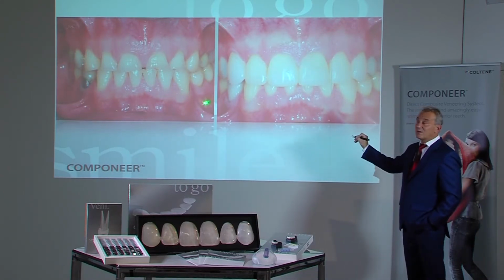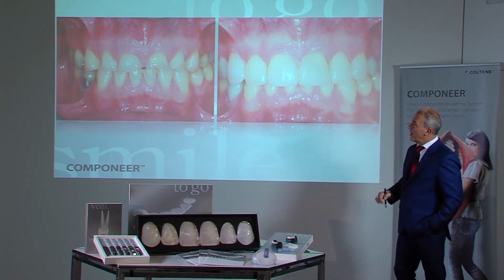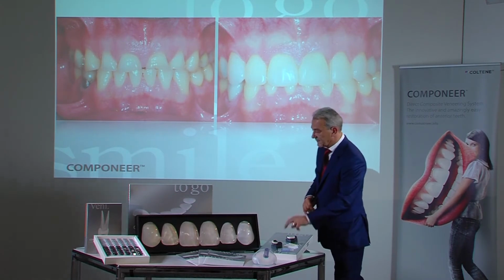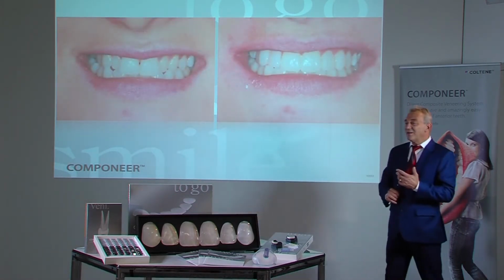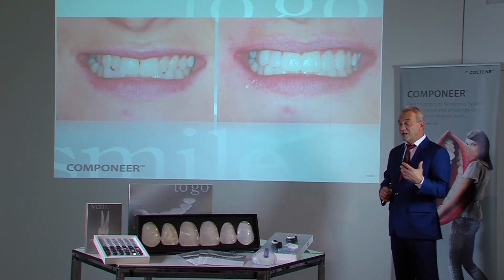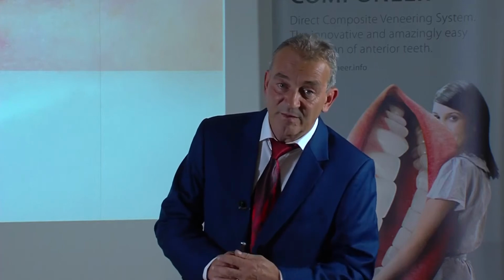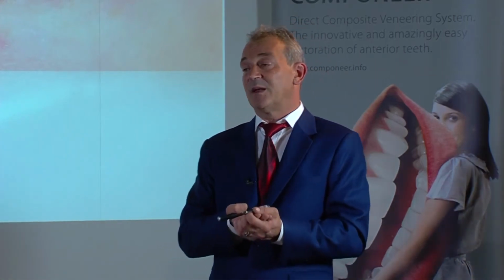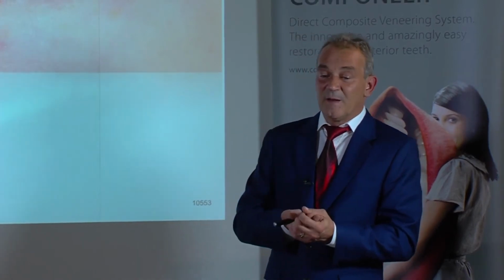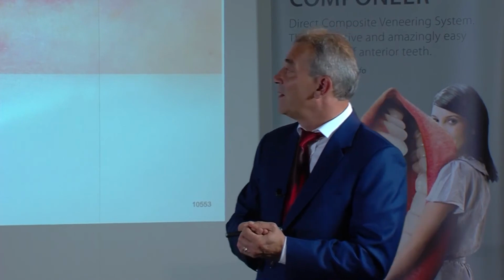We can see the final bite situation before and after treatment. The patient can now bite normally. In such cases, it is advisable to recommend a protective splint. But one can also wait. A palatal counter-abutment had been prepared after all. However, should anything break, one would advise the use of a protective splint overnight.